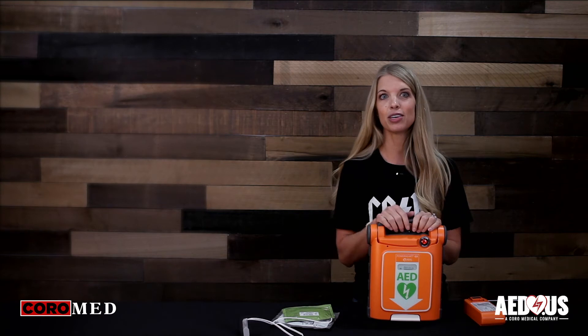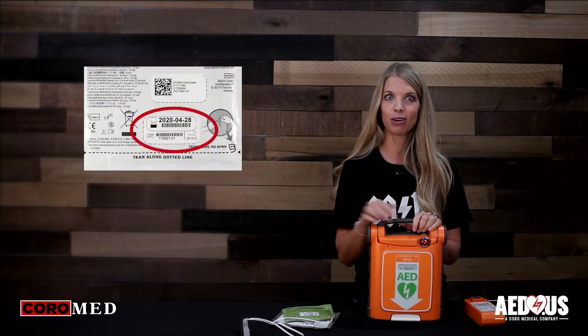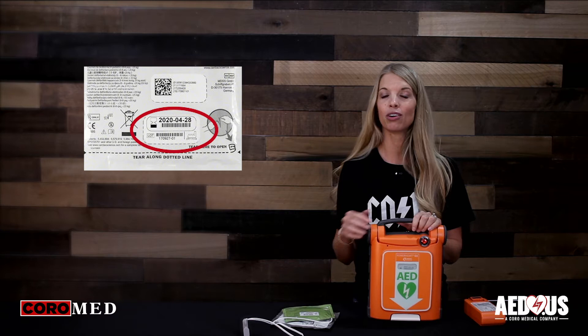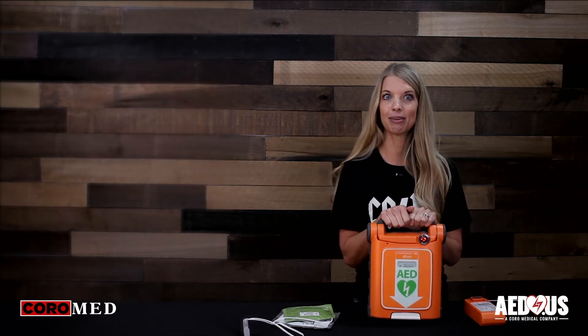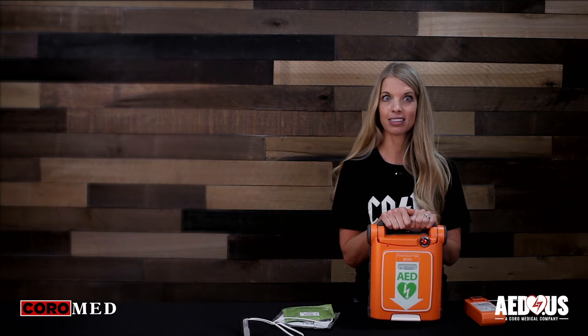The pads have a two-year expiration. The expiration date is located on the outside of the package. You can also see the expiration date through the clear window on the front of the AED. You're going to change these pads at the time of expiration or if you use the AED.